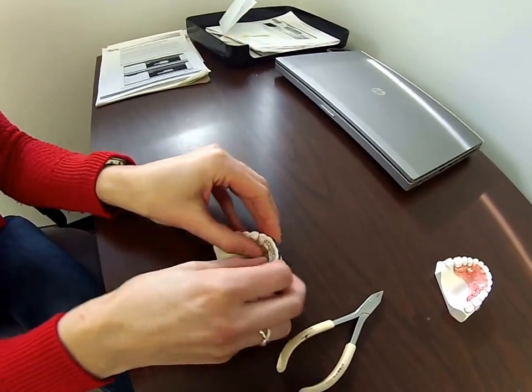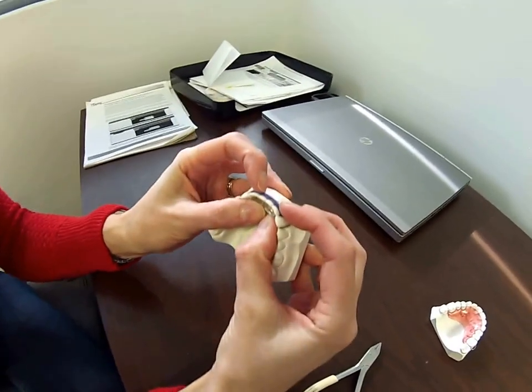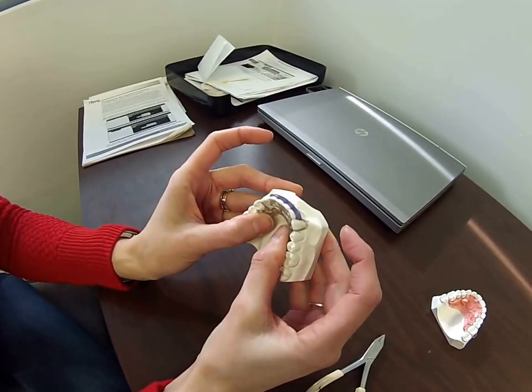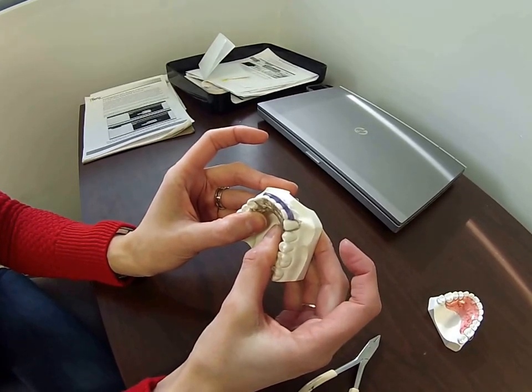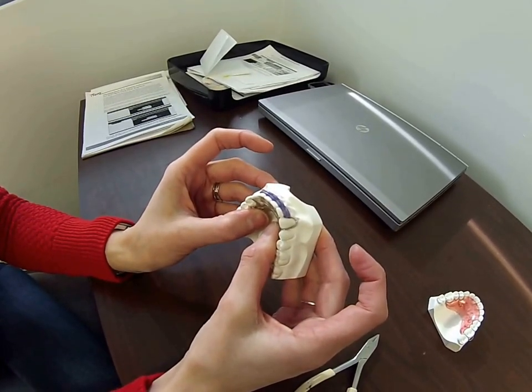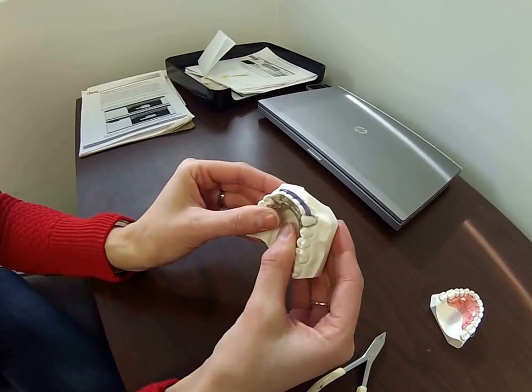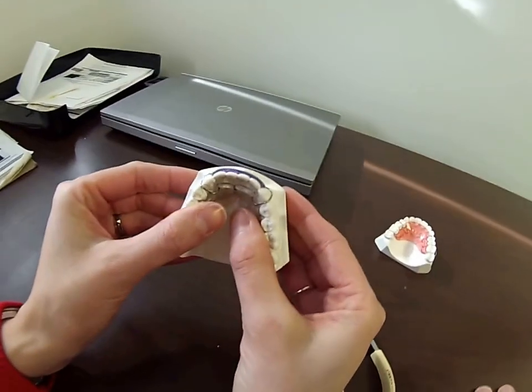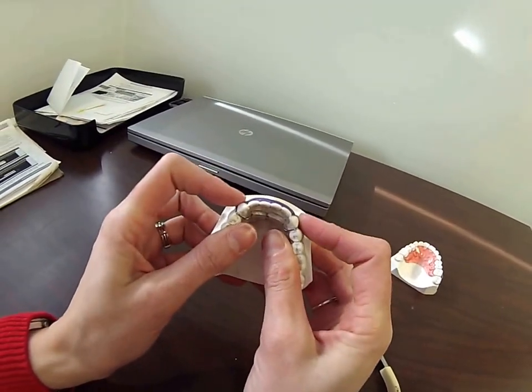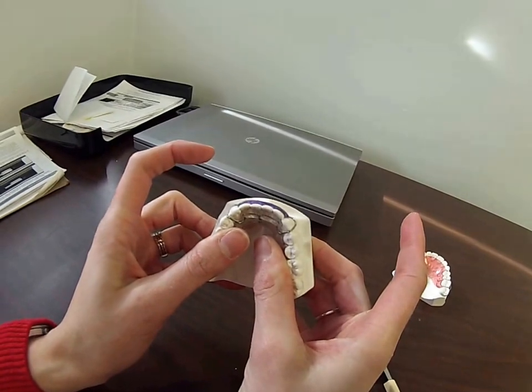You want to do the bends incrementally, both left and right, because the labial acrylic is specifically contoured to each tooth. If you do all the bend on one loop it's going to skew the acrylic off to one side. You can see this is nice and tight up against the labial surface. The canine loops are tight up against the canines.